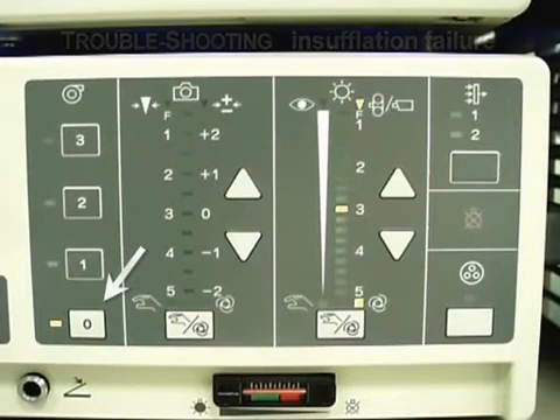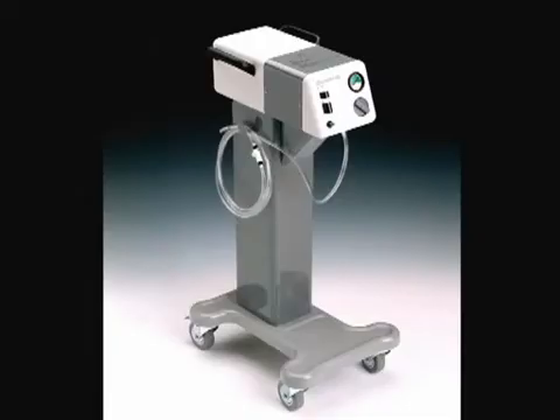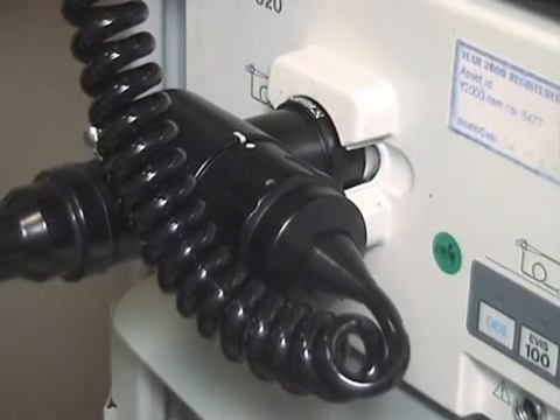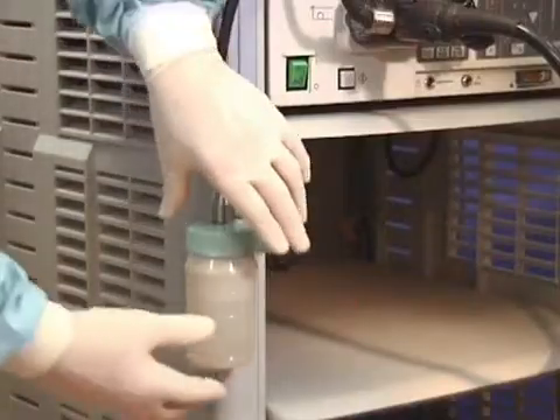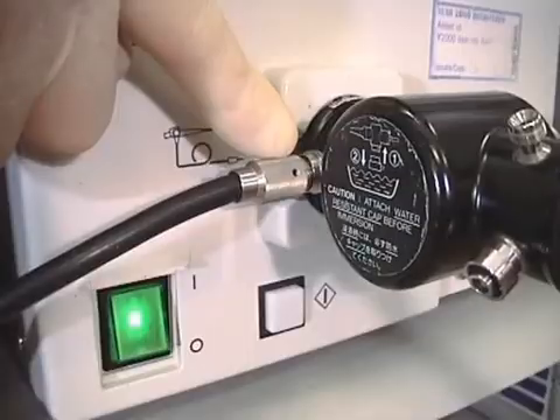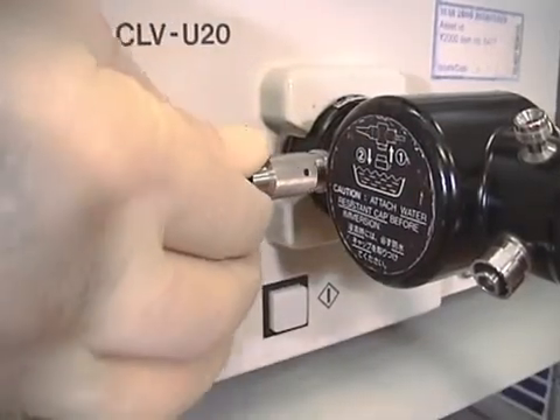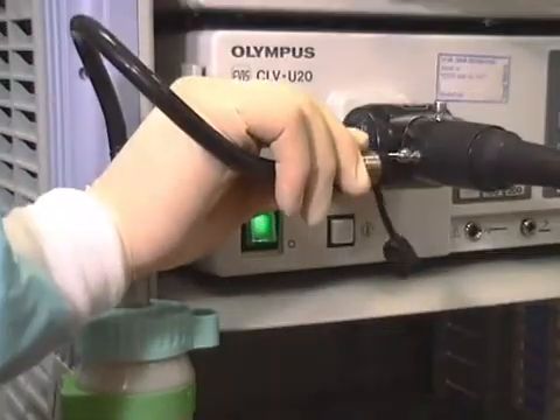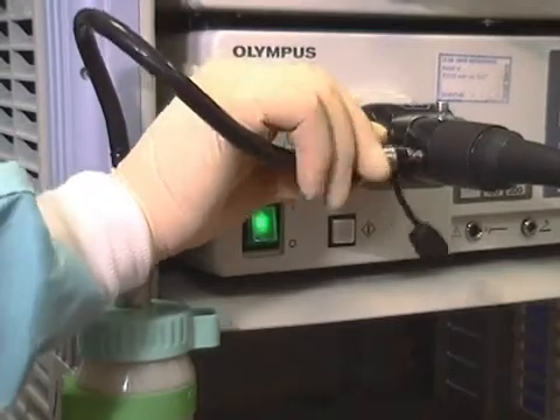If insufflation fails, check: is the air pump switched on, or the CO2 cylinder on and full? Has the umbilical pulled out, which disconnects the air supply? Is the water bottle cap screwed on tightly? In older scopes, is the water bottle connector pushed in and is there an O-ring present? In newer scopes, the twist connection avoids this problem.